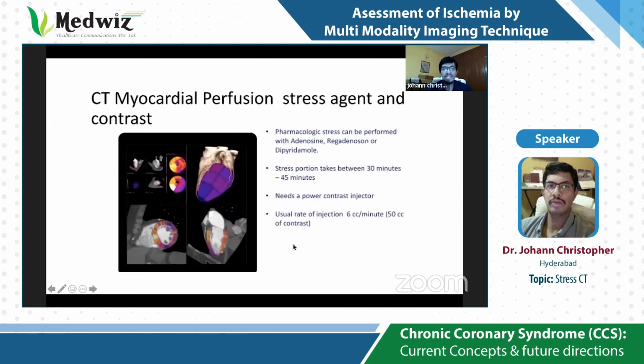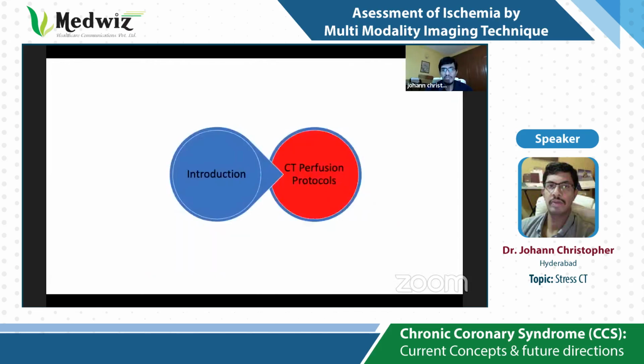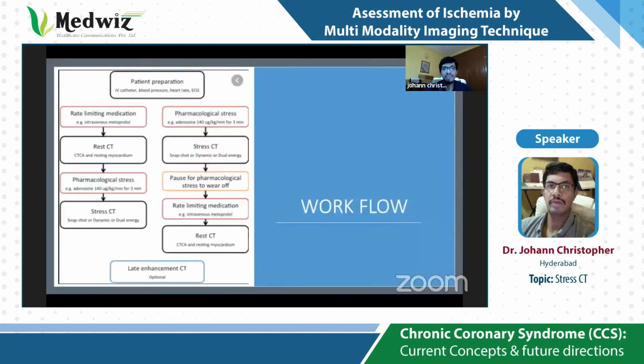You need a dedicated lab for this. You need about 45 minutes of time to do the stress and rest, and you need a very well-tuned team. Now, what about the protocols that we use? Well, there are two schools of thought.